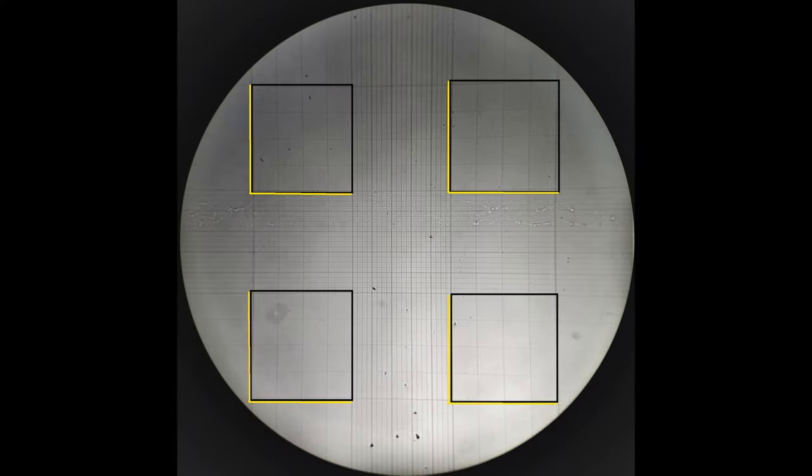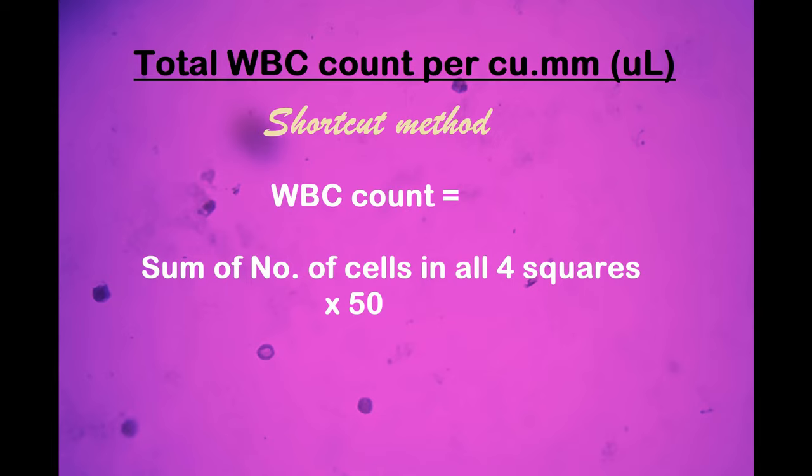Once you've counted the number of cells in the four squares, the 64 smaller squares, all you have to do is just add them up and multiply the sum by 50. This gives you the total WBC count per cubic millimeter of blood sample.